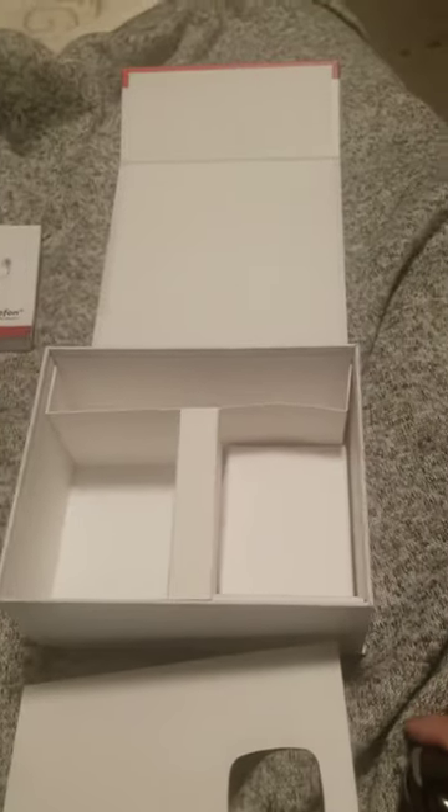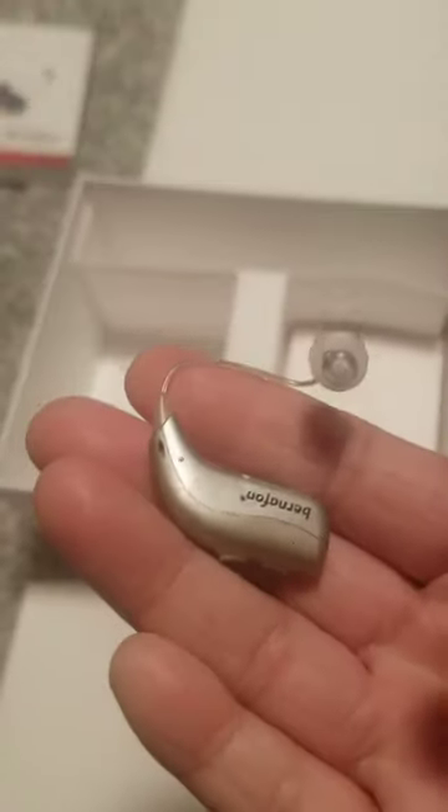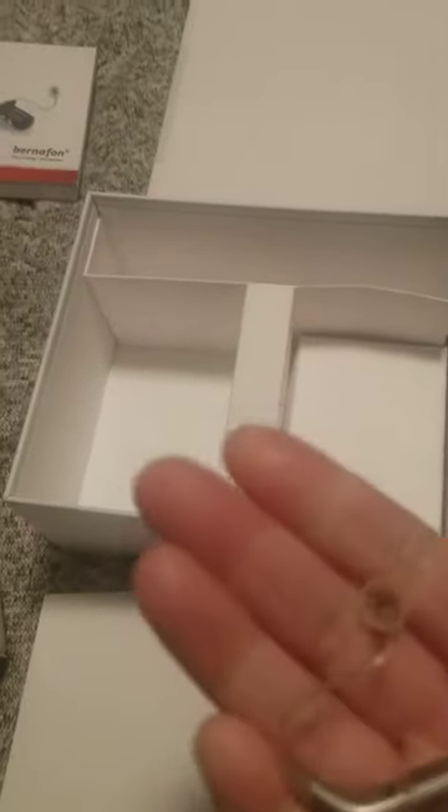There's the case, and there's your hearing aid. This is the left — marked in blue — and this is the right.